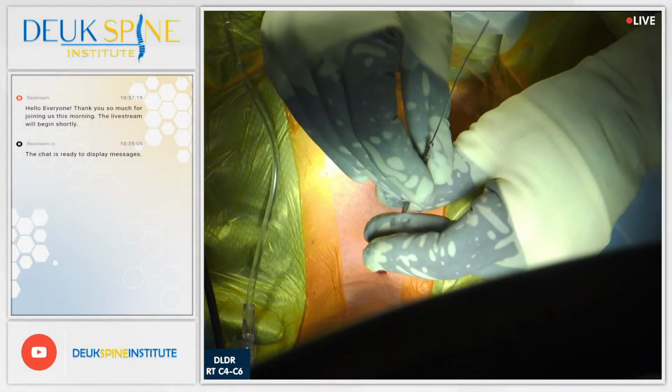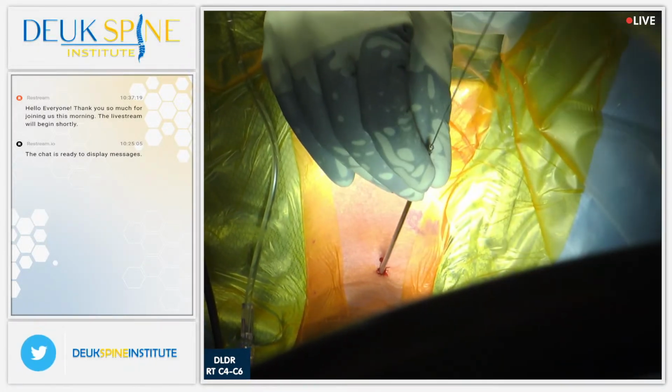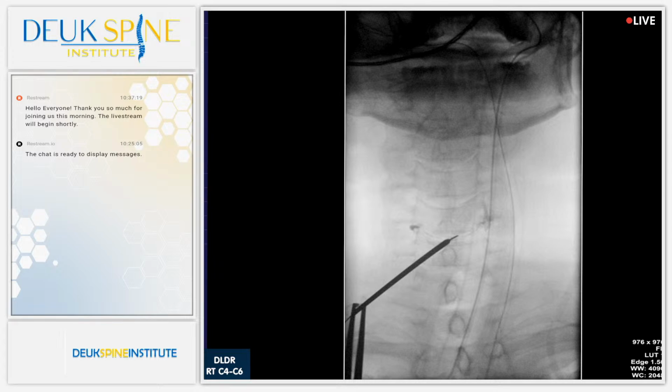All right, I'm just wiggling my little dilator down to the spine. And the tip of this dilator, AP, is actually blunt. It's pointy but blunt, like a pencil. It doesn't cut. All it does is spread. And what I'm spreading, it's perfect, right in the middle.